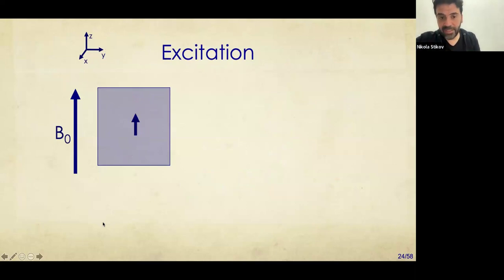And these spins will combine to create a net magnetization. In this case, the net magnetization will be aligned parallel to the main magnetic field B0. So, strong magnetic field B0, strong net magnetization. And imagine that here we have basically a glass of water, and we have just magnetized the water. Now, nothing exciting happens until we start manipulating this magnetization. At the moment, the magnetization is just parallel, stays there, your body's magnetized, but you cannot make an image that way.